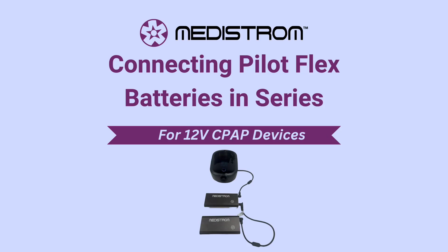In this video, we will be showing you how to connect multiple PilotFlex batteries in series to a 12-volt CPAP machine. This can be done to get an extended battery life. Please note that you can connect an unlimited number of PilotFlex batteries together to achieve the augmented battery life you desire.